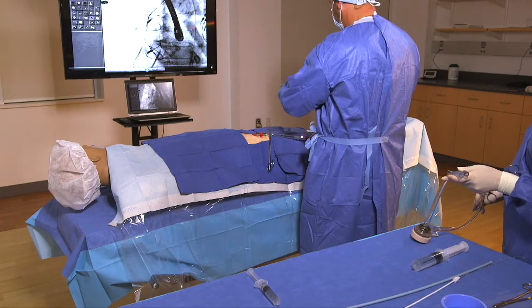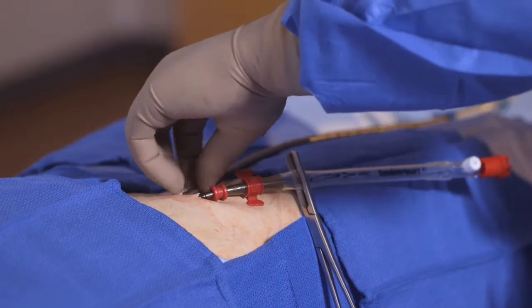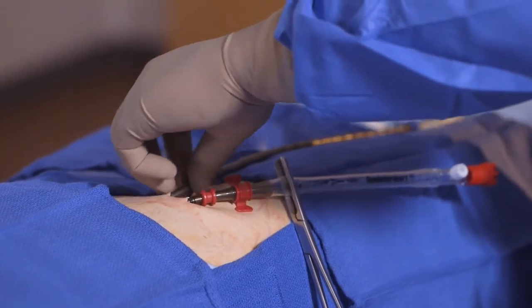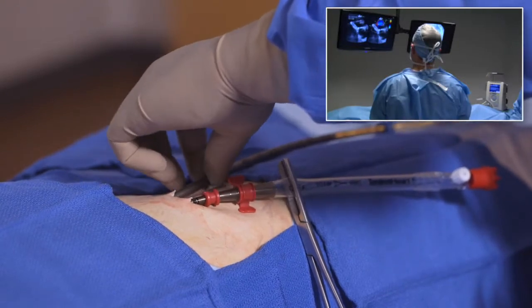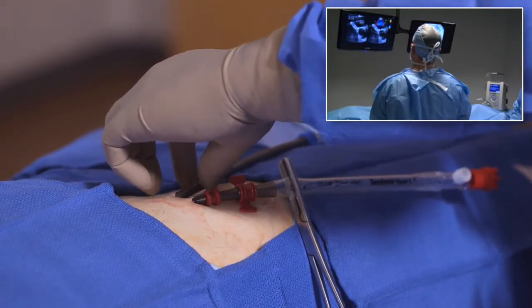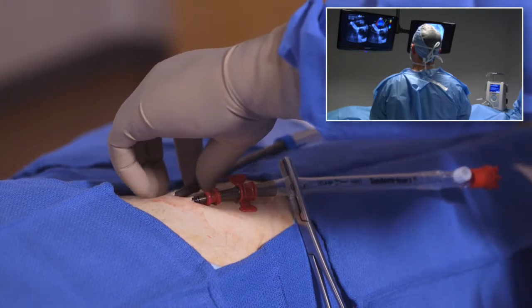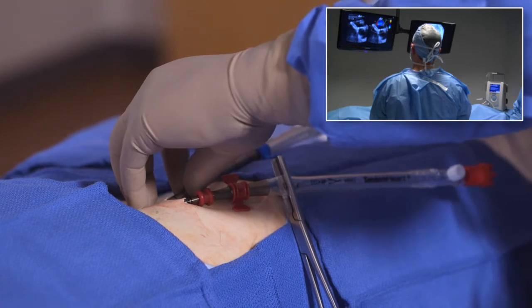Insert the introducer cannula assembly over the guide wire into the left atrium. Confirm the position of the tip of the transeptal cannula inside the left atrium using pressure transducing, blood gas analysis, and echocardiography.